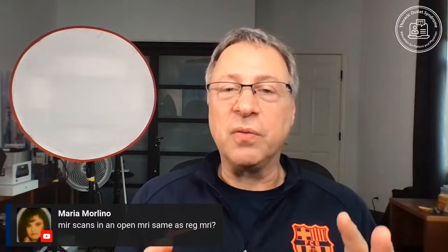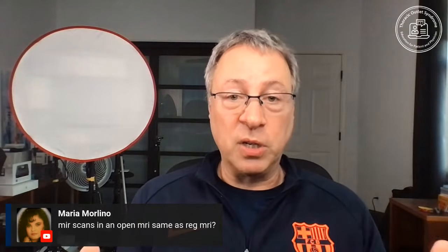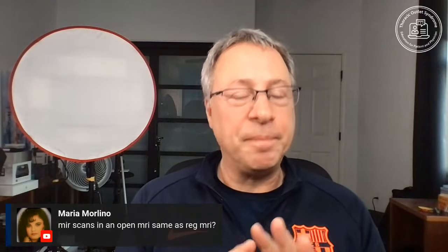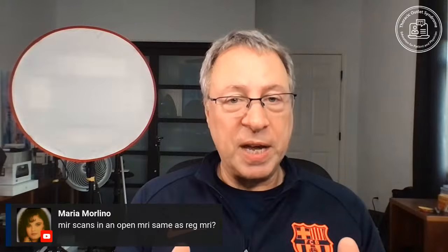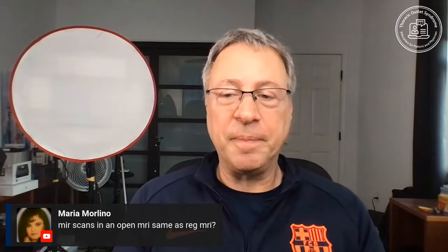I would say this, for my purposes, to make the diagnosis of TOS, to provide your doctor with the necessary information, a 1.5 Tesla magnet is plenty. If we have a 3 Tesla, we might get some more information, but it's not at all necessary.